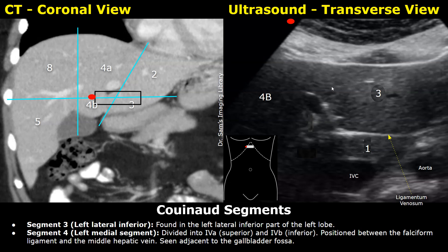The ultrasound image on the right is in transverse plane. The probe is placed in a transverse orientation with the indicator towards the patient's right, moved away from the midline towards the right, just touching the costal margin, or placed between the ribs in the intercostal spaces. To get a transverse image of the liver, we can also see the IVC and aorta in cross section. Once you get this type of image, you will find a hyperechoic bright line — this is the ligamentum venosum. Just posterior to it is the caudate lobe, segment 1, seen between the IVC and the ligamentum venosum.